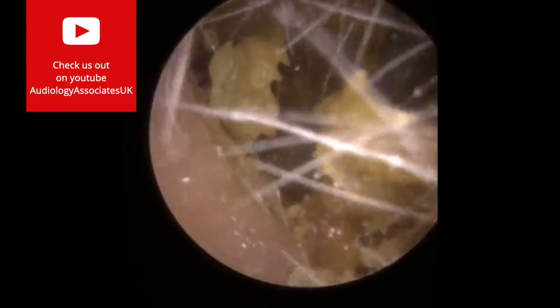So we are using the Jobson horn now, just going over the top of the wax, and you can see these pieces breaking away here. Just breaking some of those pieces away and taking them away.